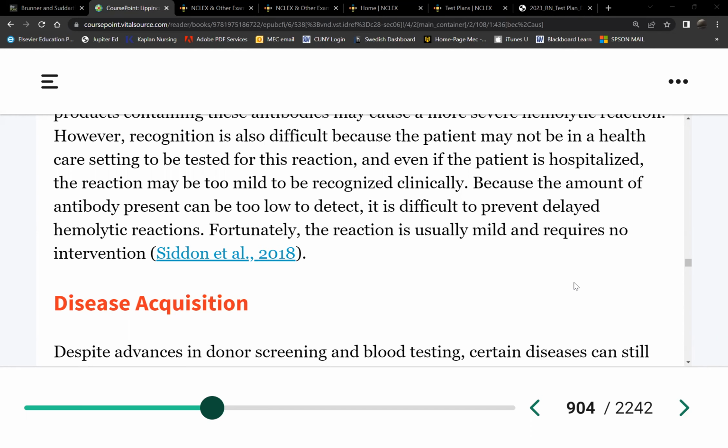How come this is not clotted? It wasn't frozen when you were sitting for 10 minutes in the blood donation center. What's in here? Citrate. They put citrate from the tubing, this tubing here that they cut. This is the tubing that went from you, from the needle. So they crimped it. Everything from the line, the tubing to the bag have citrate in it. Meaning, what's in this blood also? Citrate. So did you receive citrate when you got this bag of blood? Yes.